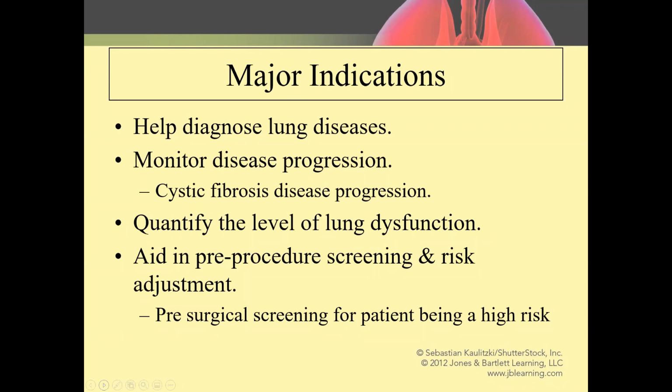So 2 or 3 times a year, perhaps if they go into the hospital regularly for, let's say, a tune-up, more of a preventative visit, they will probably have a battery of pulmonary function tests done when they come in. It'll be done at least every year to monitor and quantify their disease progression, or hopefully lack thereof.